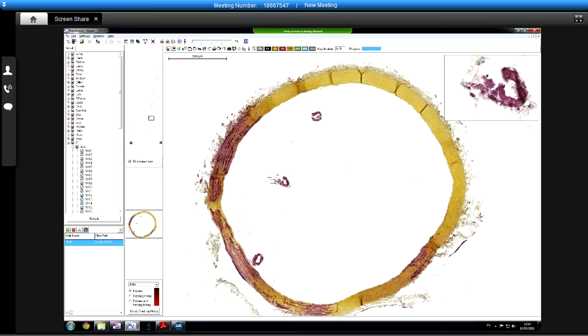Okay, I think the way we can do that then is we could mark a ring around the outside and then mark the inner ring as well, as it were. And what we'll have to do, I think, is two counts and just take one away from the other, if that's okay. Yeah, because on a lot of the slides, there is stuff in the middle. So there are plans, and hopefully at some point there'll be an update which will allow you to do exclusions or do more complex shapes, such as mark a donut, because it's quite a common request.